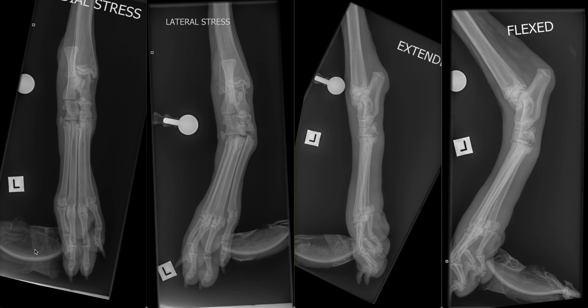When a lateral force is applied to the lateral aspect of the pes, resulting in medial stress of the joint, there is not increased widening of the lateral joint spaces. However, when a force is applied to the medial aspect of the pes, resulting in a lateral stress of the joint, there is widening of the medial aspect of the tarsometatarsal joint spaces and a slight step of the lateral aspect as well.